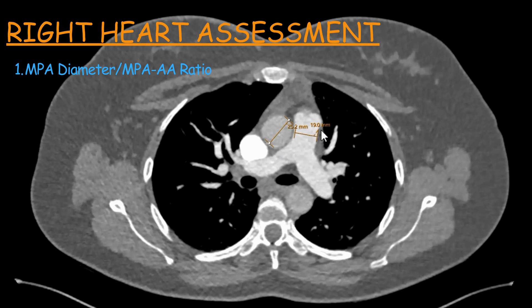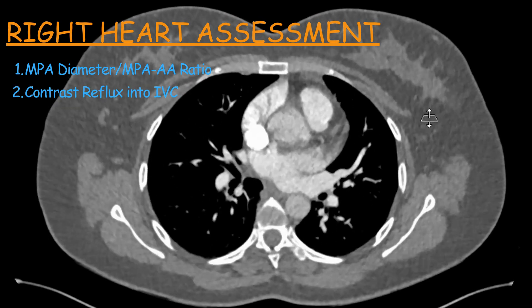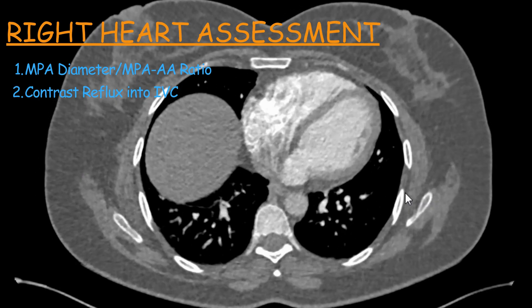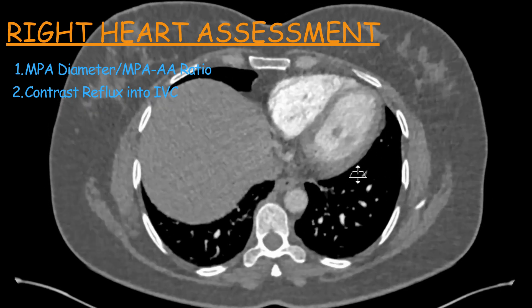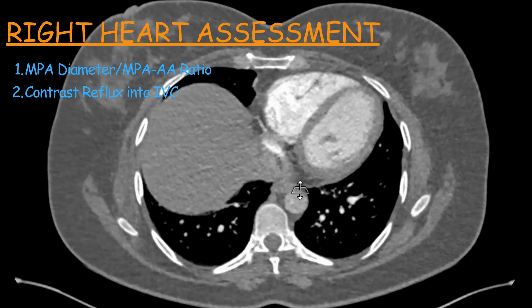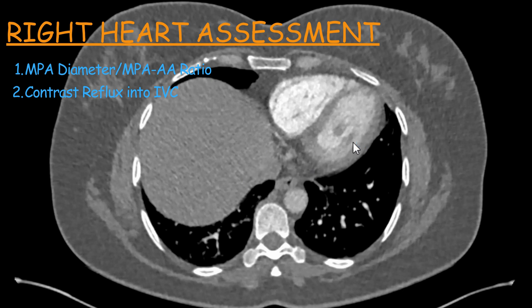Although in children, the pulmonary artery diameter can normally be higher. In adults, a ratio greater than one — meaning the main pulmonary artery diameter is greater than the ascending aorta diameter — is considered abnormal and one of the signs of increased pulmonary artery pressure. The second sign is looking at the reflux of contrast into the IVC. In this case you can see there is no reflux of contrast into the IVC, and I'll show you a few examples of how reflux of contrast into the IVC and intrahepatic veins looks.